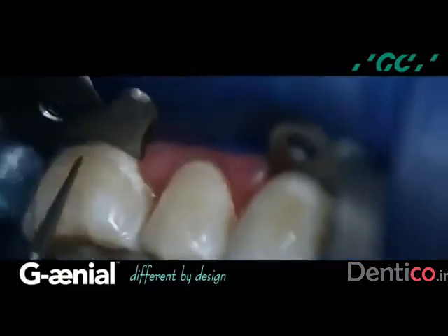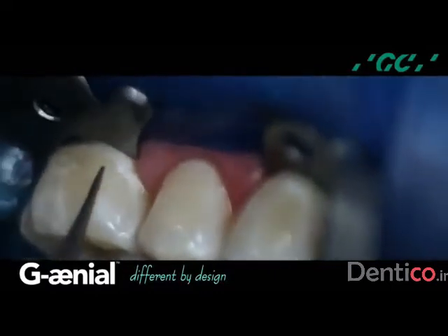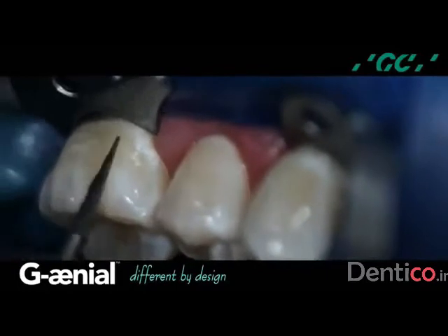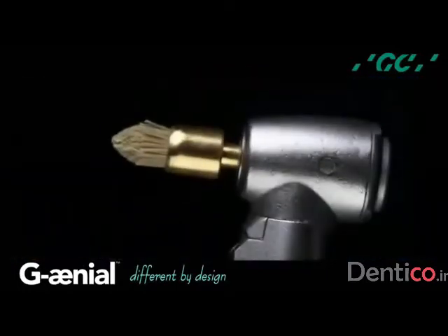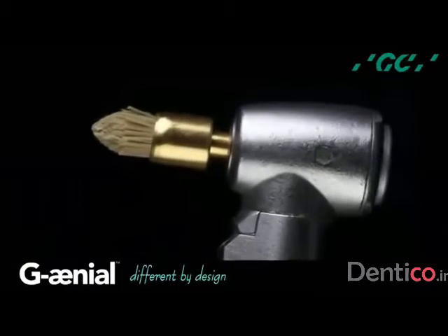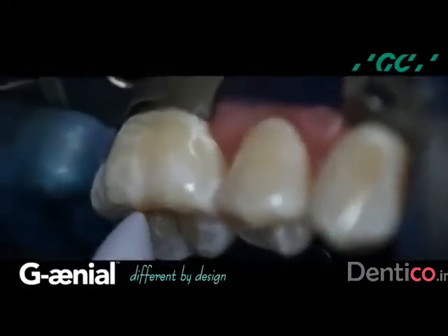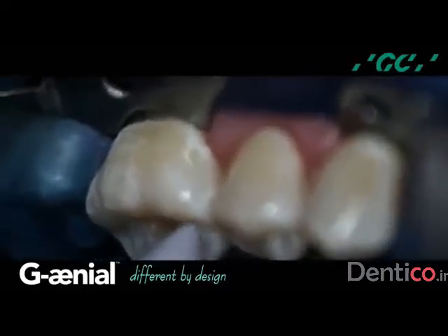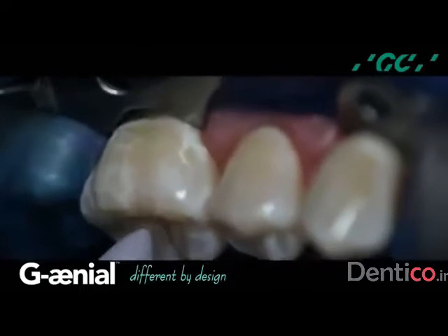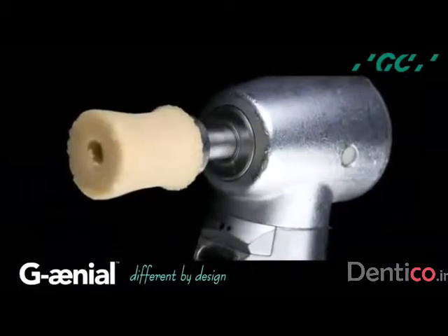The buccal surface is contoured and smoothed with a 30-fluted DET9 needle-shaped finishing bur by Brasseler. A silicone-impregnated brush, a Composite Pro by Brasseler, is used to enhance the smoothness. A silicone point, an ET Illustra polisher, is used to give a high surface reflectivity while maintaining the precisely developed anatomical contours. An enhanced foam cup with loose abrasive diamond paste is used to create a high luster.